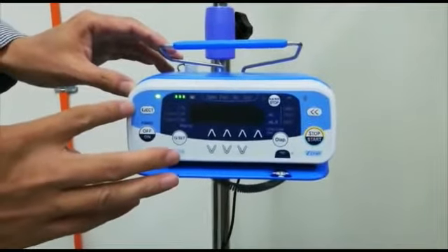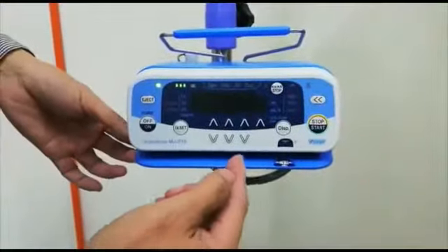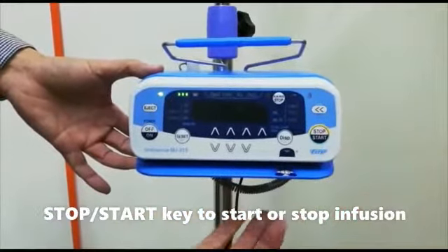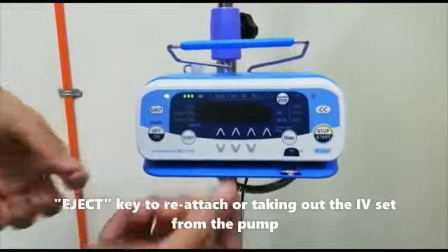We don't have a door. This area is for putting the IV set. There's a flow area indication here. Then there's a button here, I'll explain. This is to start or stop the infusion. This is to switch on and off. This one is to eject the IV set.